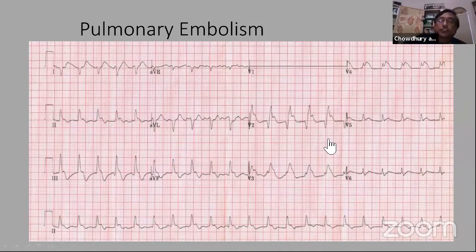What should I do? The cath lab was saying, do you want us to take this patient to the cath lab? I asked one question to the nurse actually: what was the rhythm when the patient coded? The patient coded with pulseless electrical activity. Remember, if it is a transmural MI giving an injury pattern, and we should be able to read it in the presence of right bundle, it can be anterior MI, but the code would be expected to be VFib. MI patients going into PEA arrest is rare.